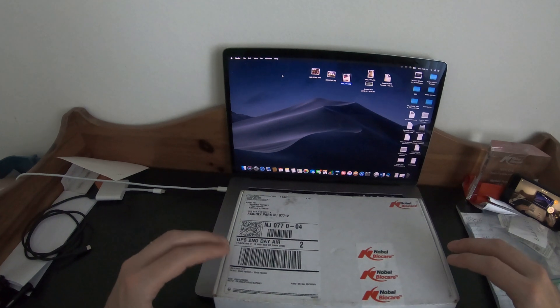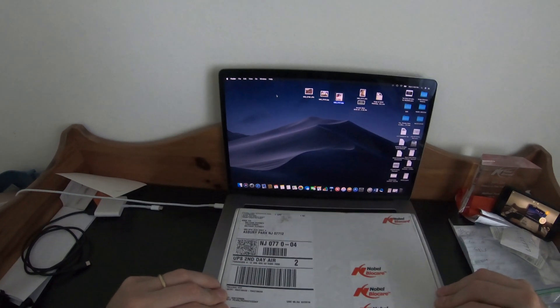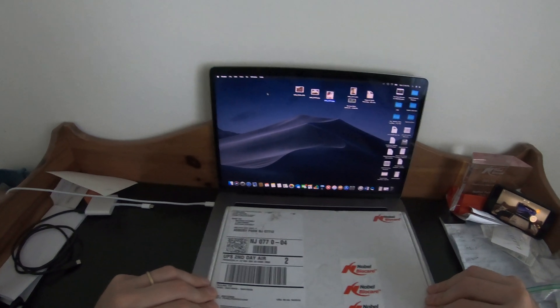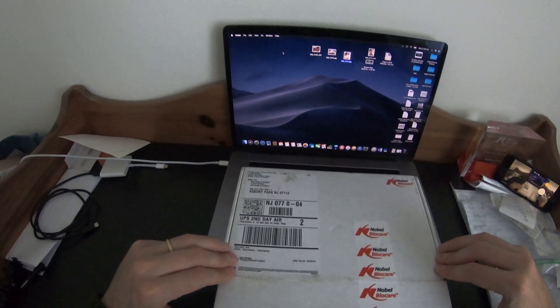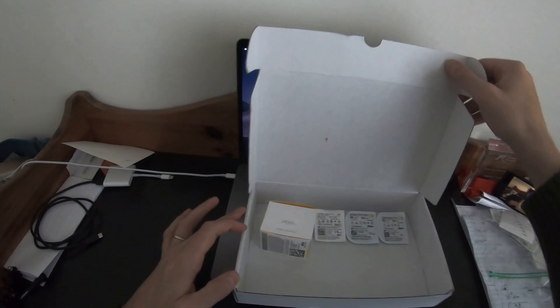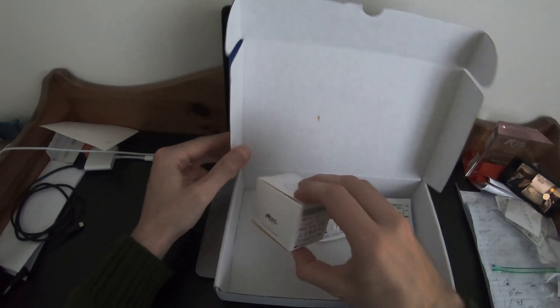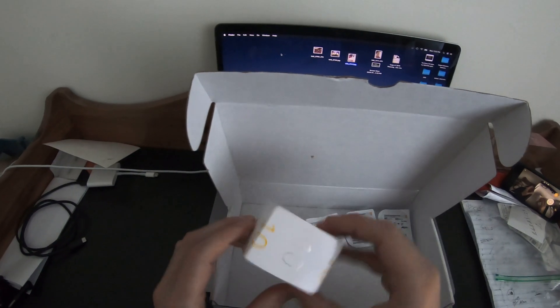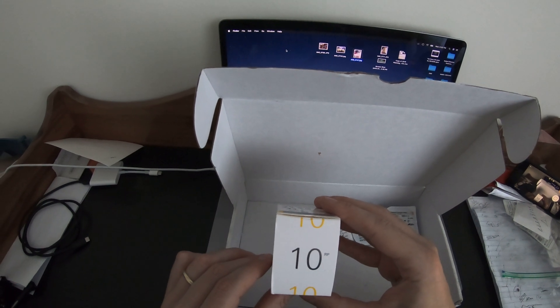Today we got in the brand new Nobel Pearl, which is Nobel Biocare's full ceramic zirconia implant. Let's take a look at what we have in the box. We have the implant itself — it's a 10 millimeter regular platform.